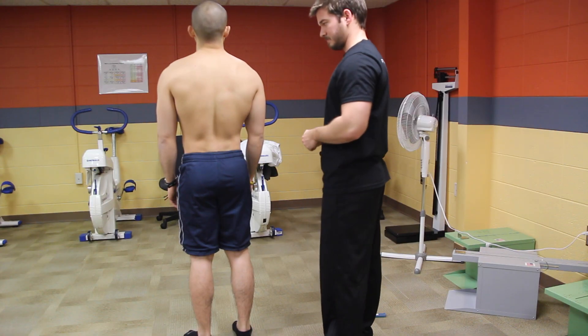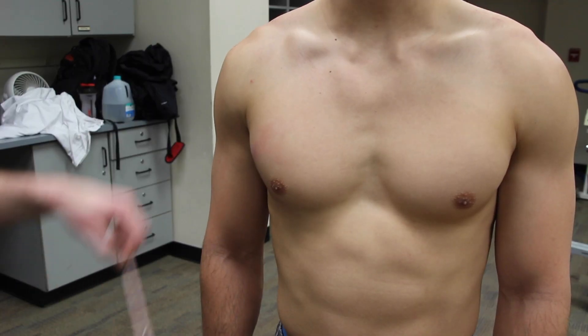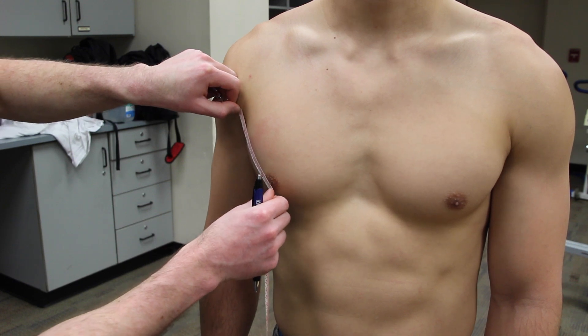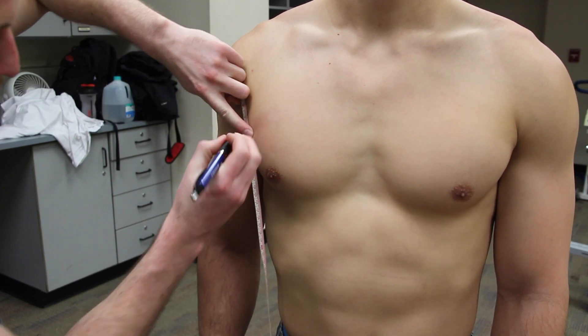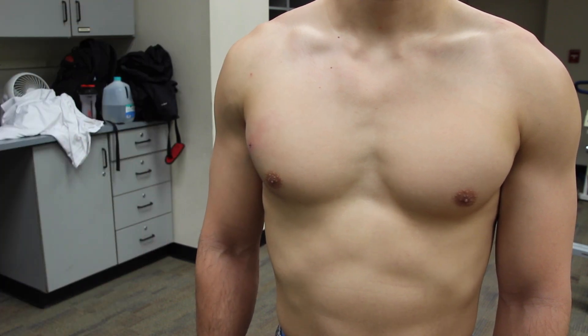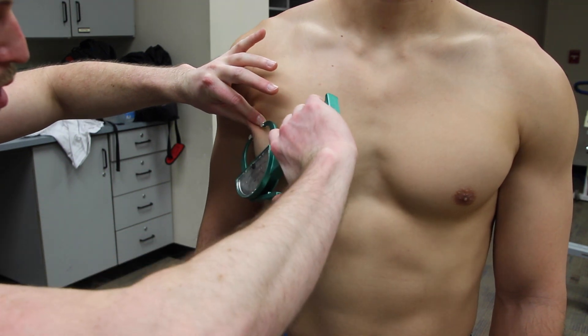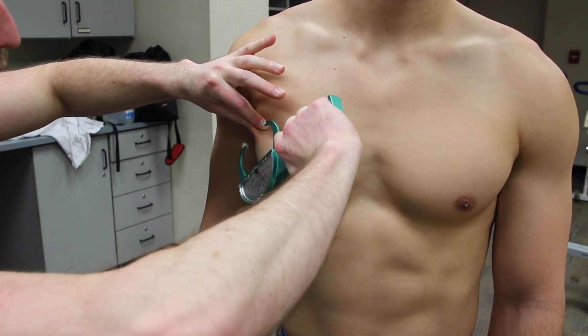When you've completed that, have your client turn to you so you can measure the chest site. Measure half the distance from the axillary fold to the nipple and mark your spot. Come in with your calipers for a diagonal pinch, obtain your reading and release.